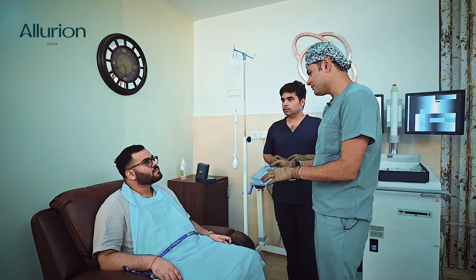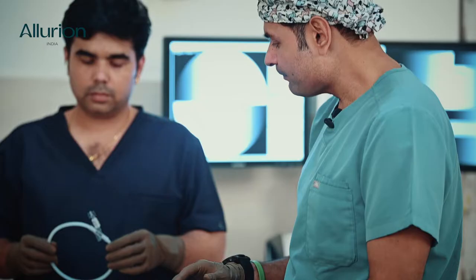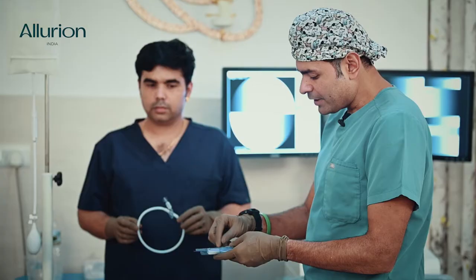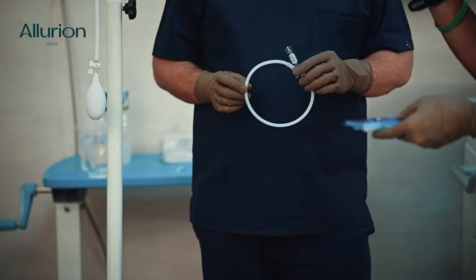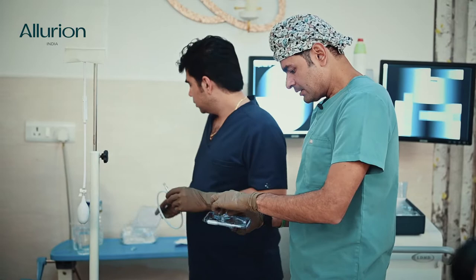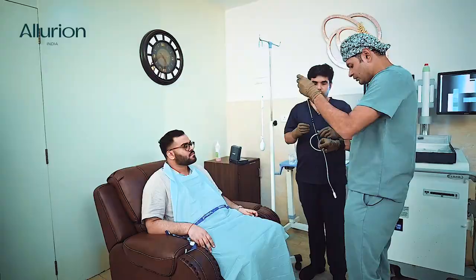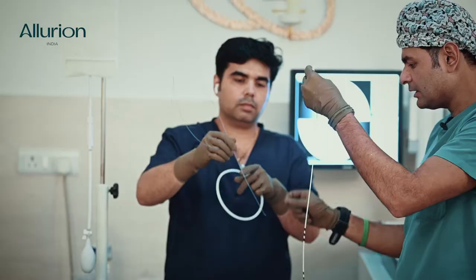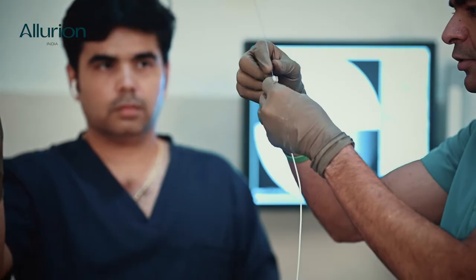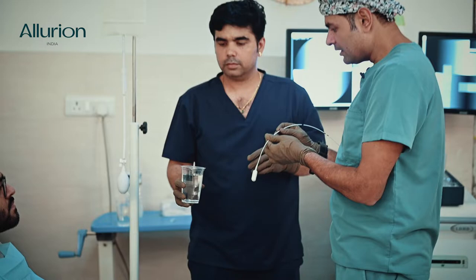To assist your swallowing of this capsule, we are going to use a stilet. A stilet is a device that makes the catheter a little bit rigid so that you don't have any problem gulping it — we assist you to gulp it very easily. It's just to make things easier for you. This stilet has a very soft tip and its basic purpose is to make the swallowing easier.